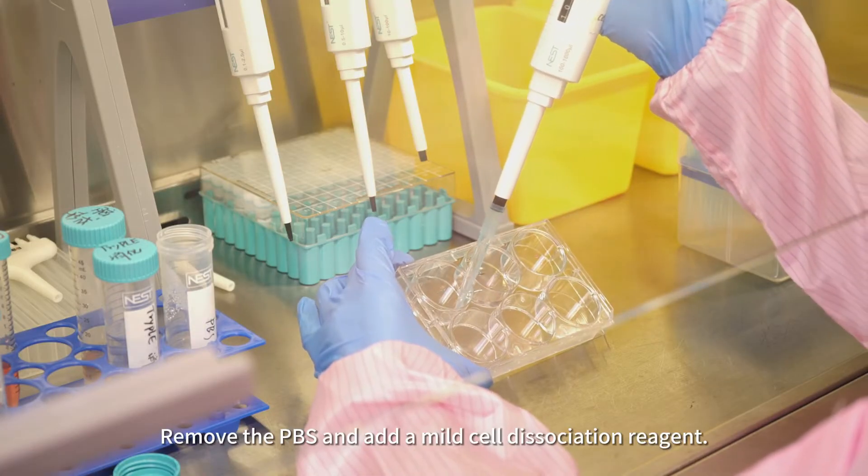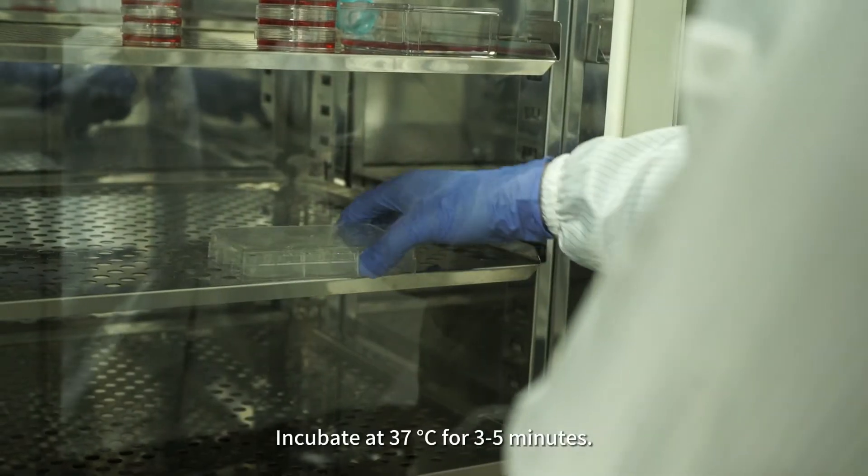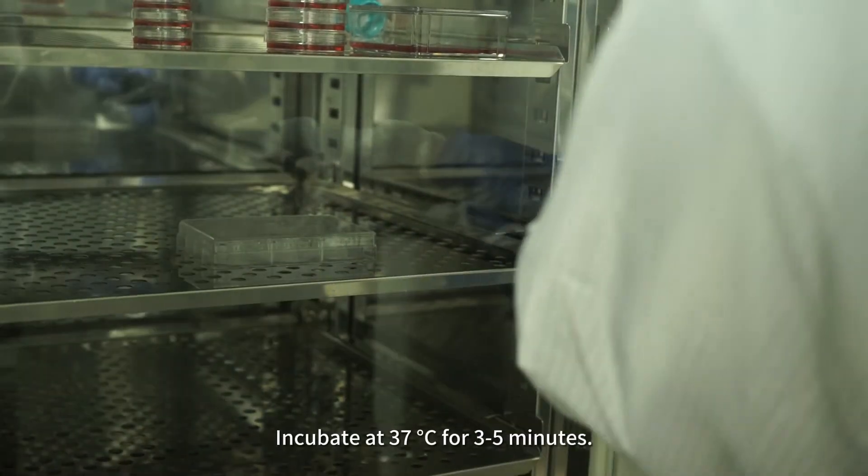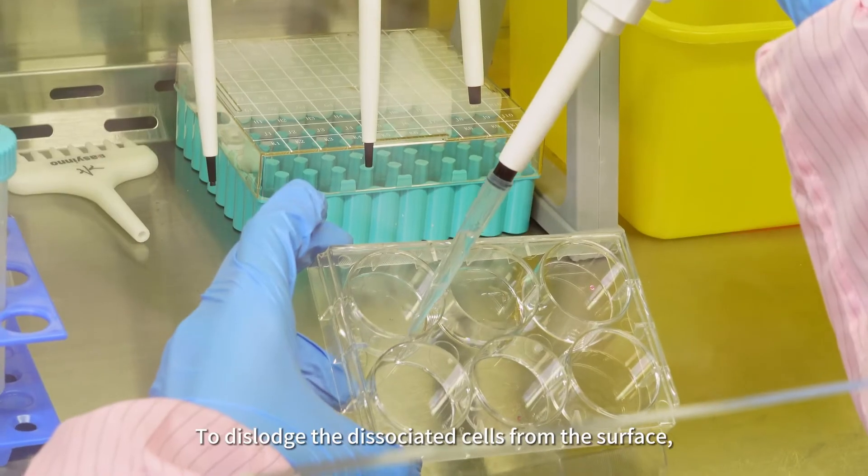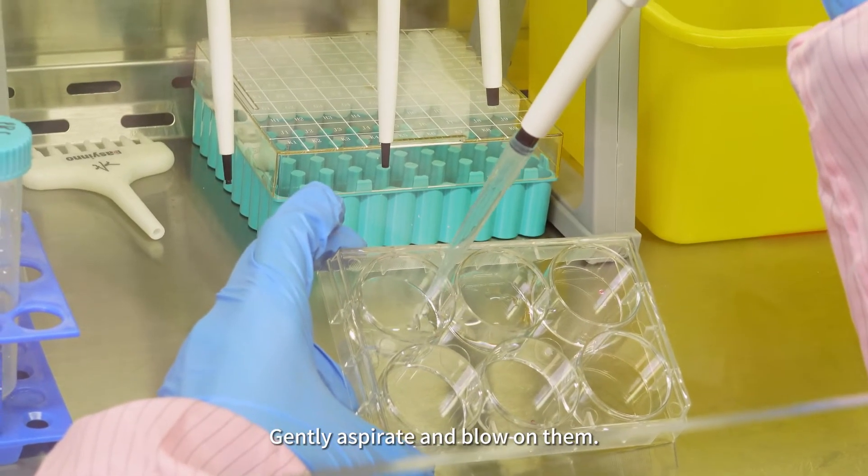Remove the PBS and add a mild cell dissociation reagent. Incubate at 37 degrees Celsius for 3 to 5 minutes. To dislodge the dissociated cells from the surface, gently aspirate and blow on them.